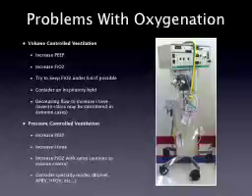I want to be very cautious with increasing the FiO2. I want to keep it under 60% if I can. Clearly, if I have to go higher, I have to go higher. And if all else fails, I want to consider specialty modes of ventilation, such as bilevel, airway pressure release ventilation, high frequency oscillatory ventilation, high frequency jet ventilation, and all these other advanced modalities. The picture on the right is a picture of a high frequency ventilator.